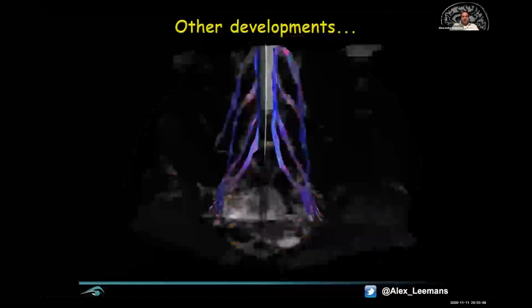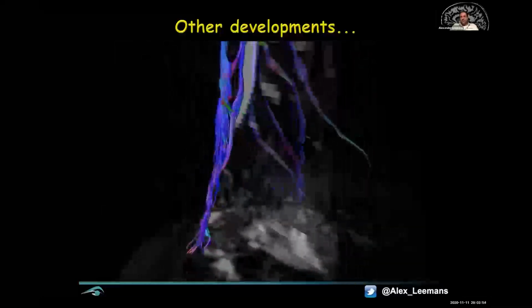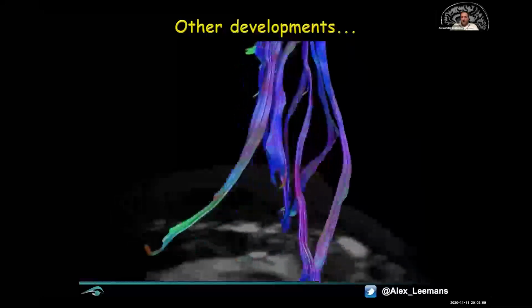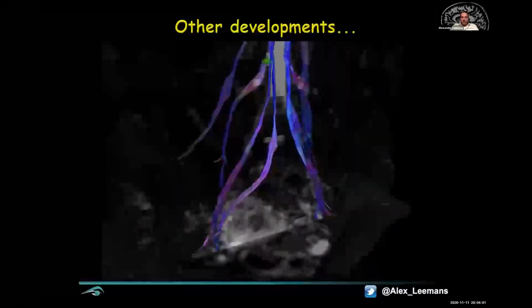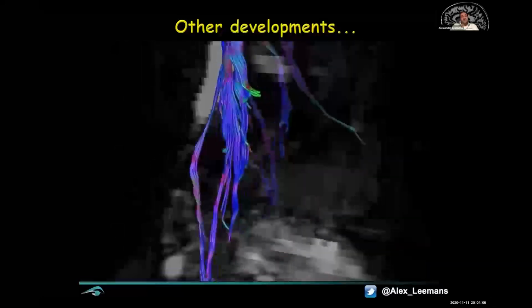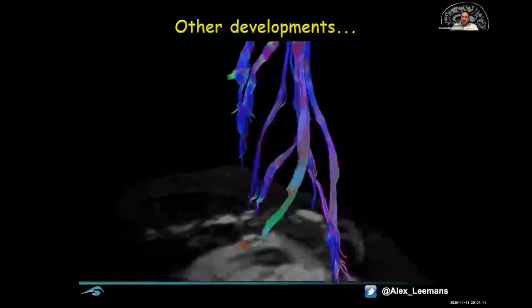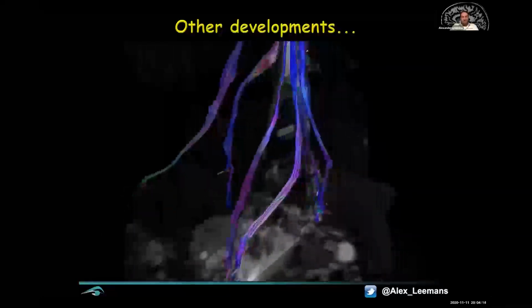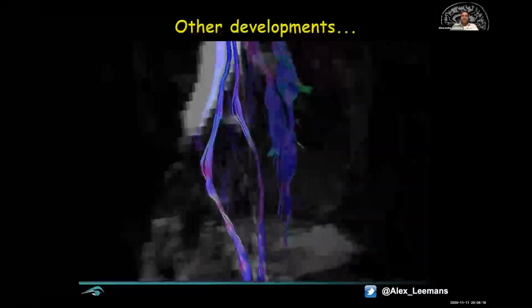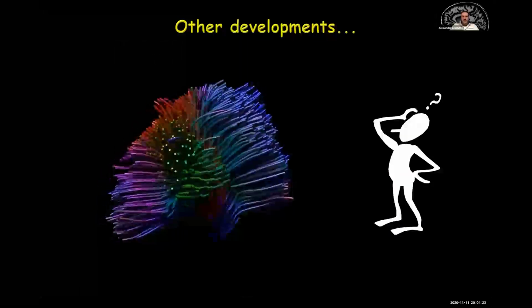But you can do more than just the brain, because diffusion MRI is about diffusing molecules. And obviously we've got molecules in other areas of our body. So in this case, what I'm showing you now is part of the sacral lumbar plexus, where we look at peripheral nerves. And so that's also very interesting to see, for instance, looking at the pudendal nerve or the sciatic nerve. In urology, people are very interested in looking at disorders, bladder disorders, etc., and how they are interlinked with peripheral nerves. And a final one, this is even a more exotic one.